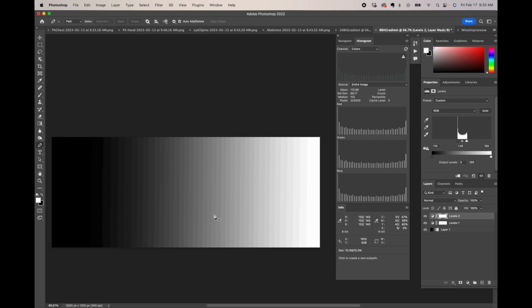In photography, particularly when you start adjusting your values, it starts introducing noise or artifacts that degrade your image quality.